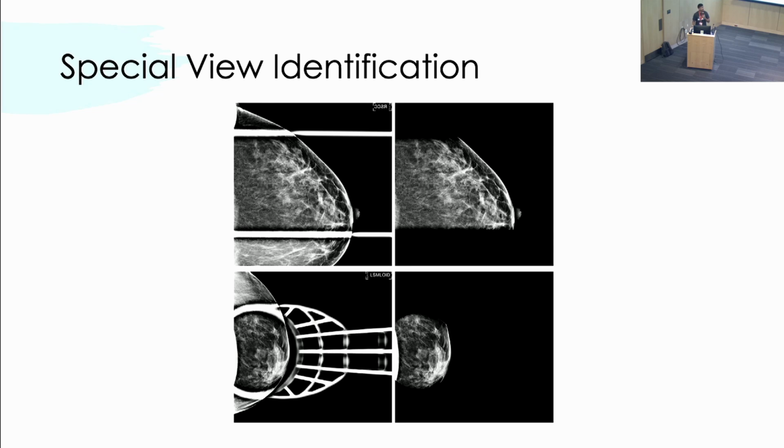It would, unless you cropped the image and took patches from it, right? So there's all these strategies. But yeah, if you put in this full image into the model, then it would learn it just as easily as the image with the paddle, right? But then if you know where the tissue is, you could take a section of that tissue in the middle and then make sure there's no blank space around it.